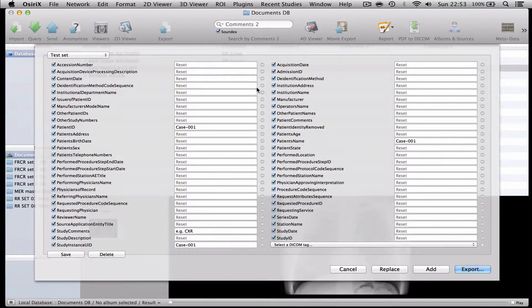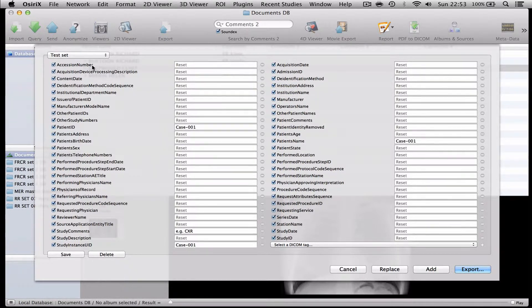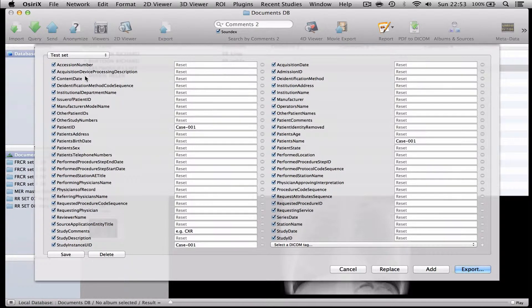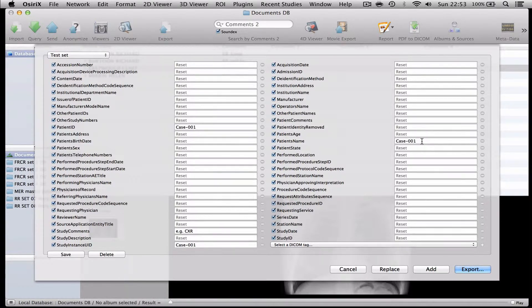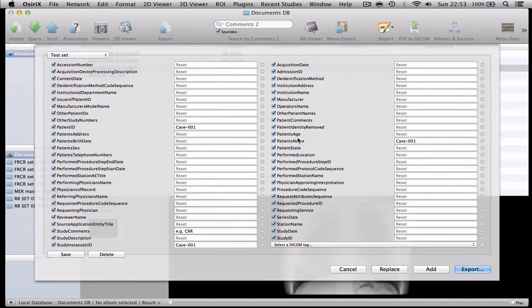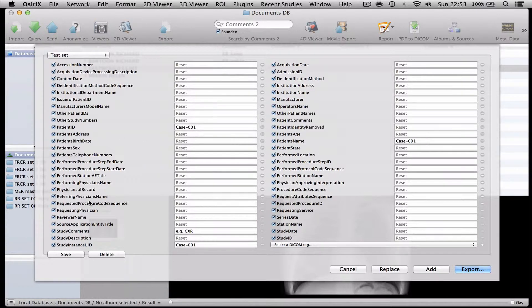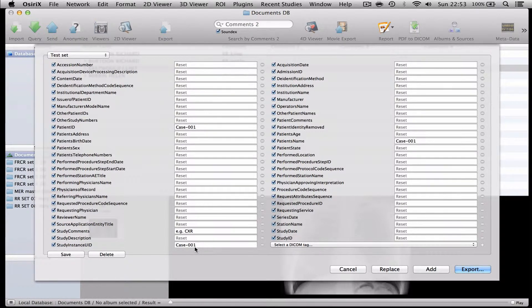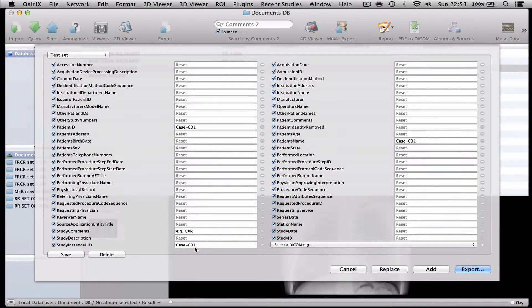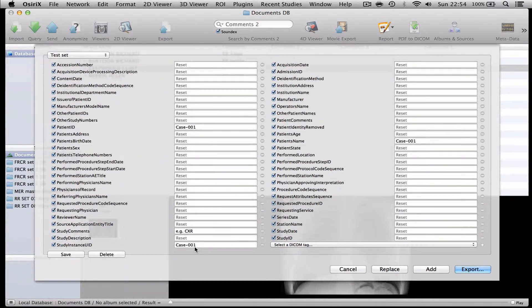But what you'll see is this anonymisation protocol will take a whole series of DICOM headers that we have selected that identify patient-sensitive information in our institution and we've set those to be cleared or reset. But we have also asked for three DICOM headers to be given exactly the same case number. So patient name, patient ID and study instance UID have all been allocated the name case 001. Now I can change that to whatever I want but it's important that I keep those three names the same if I want this case to appear on one line of the database.